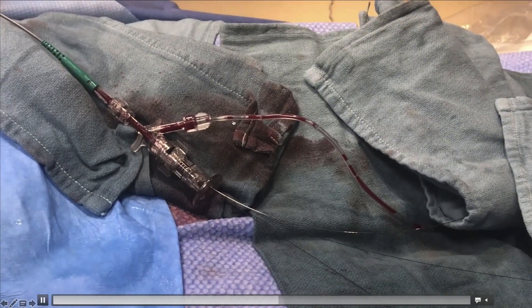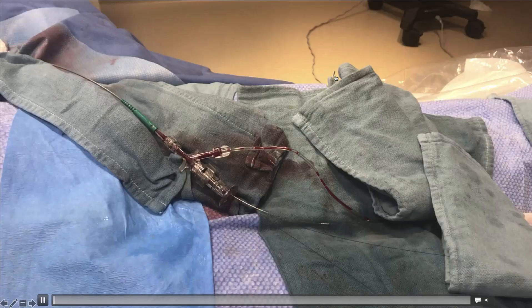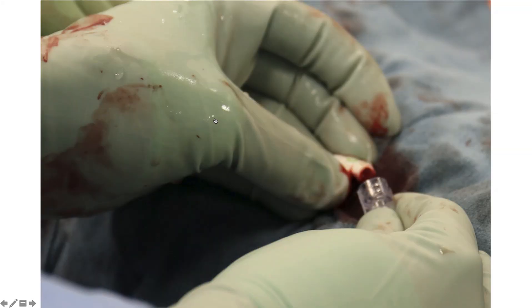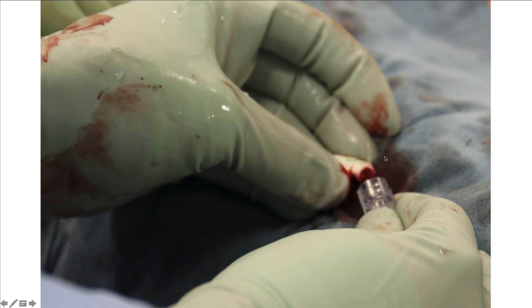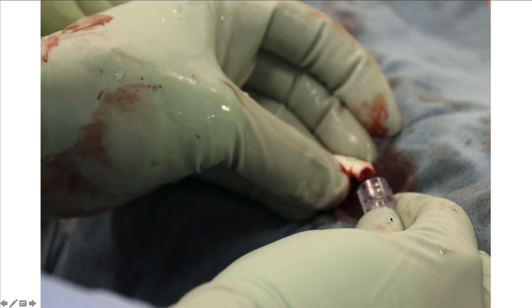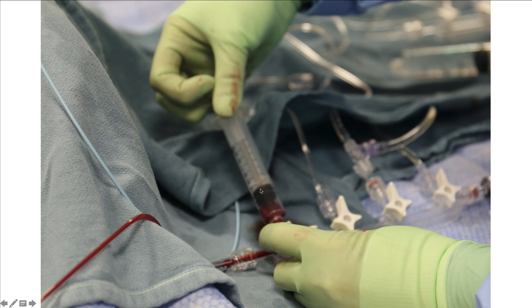This is an example of air in the line. If this manifold is not prepared and cleaned, that air will embolize in the coronary artery, likely causing a catastrophic complication. To prevent it, be very careful with connections so there is fluid-to-fluid contact, and then before injecting, there should be aspiration to remove any potential air and debris from the catheter.